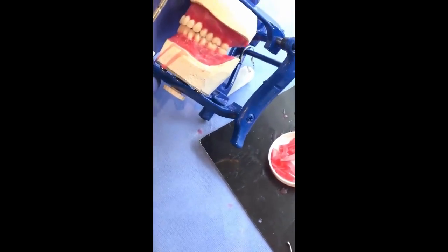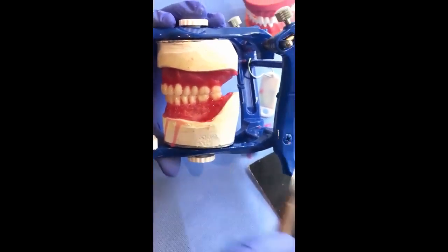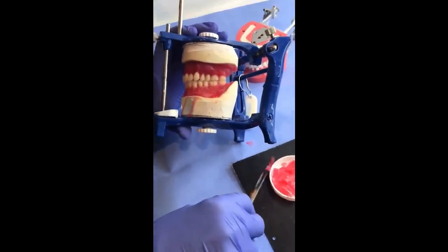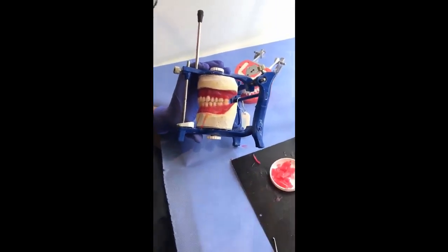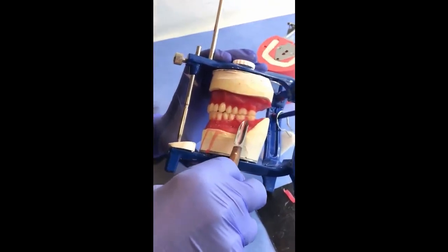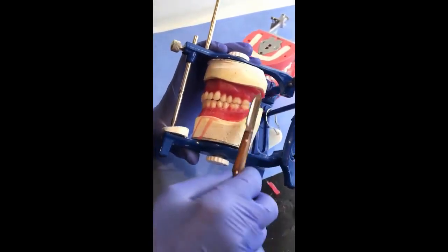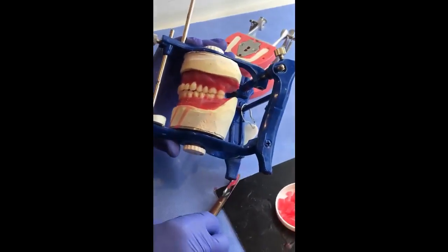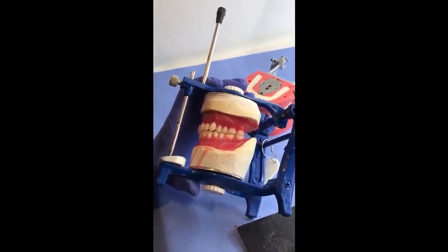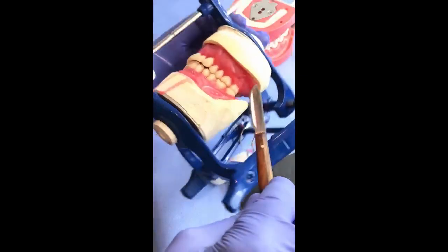Now I'm going to add wax to the lower denture from the gingival third to the borders of the denture. And as you notice, I'm trying not to cover the teeth and keep the wax around the teeth, and wait and give time for the wax to become cold and hard. And here I'm going to add more wax at this area. Now I'm adding to the labial and buccal surfaces.